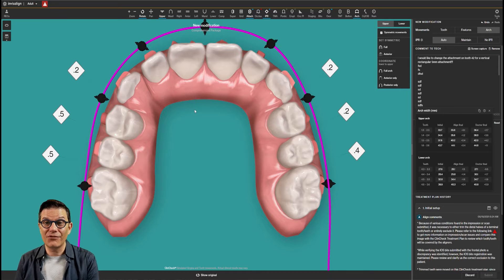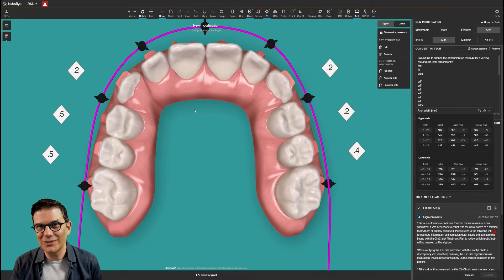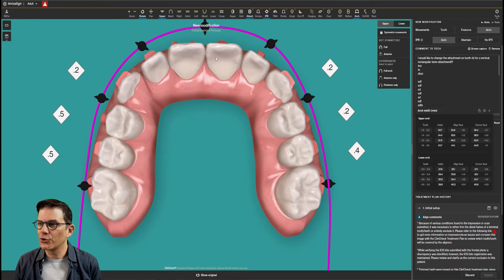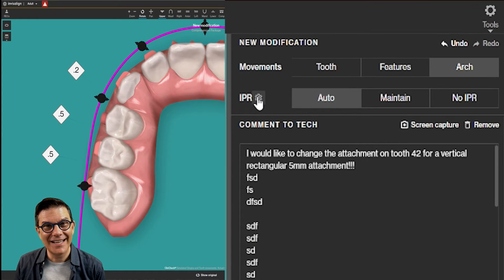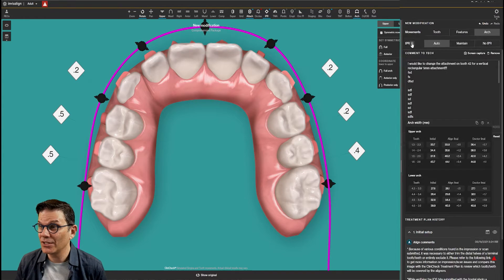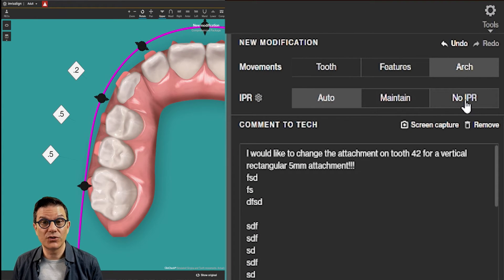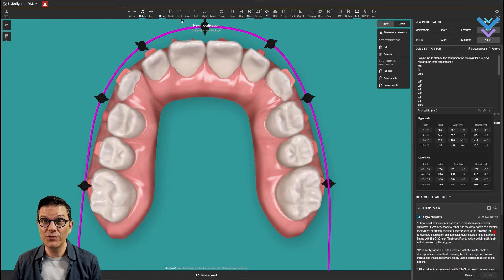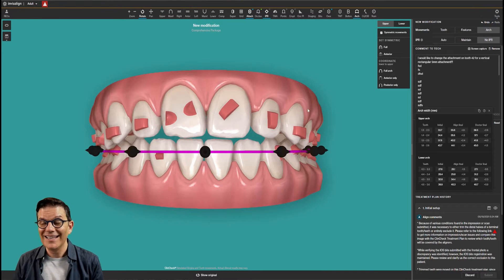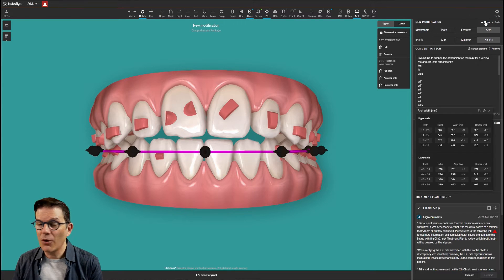There's a lot of things that can be done here. Everything — you control everything. This is where you take control of your cases. You can control the IPR. Now, you have this little gear, and if you want to know what it is, I suggest you go watch this video. Some people don't like IPR and they want to see their case without any IPR. Just click here, 'No IPR,' and it will remove the IPR. Now you see how it looks. You can go back to how it was before.